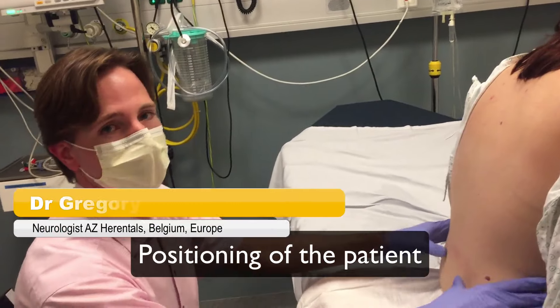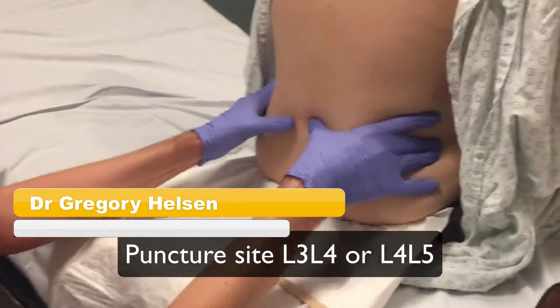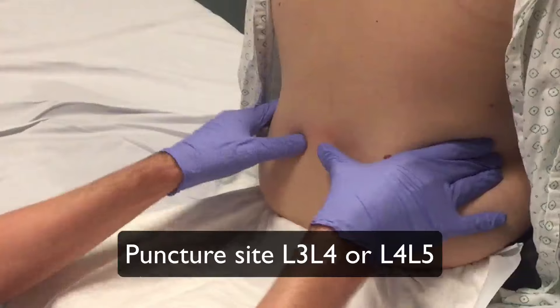The patient needs to be in a seated position bending forward, or lying on his or her side. The puncture site lies between L3-L4 or L4-L5.